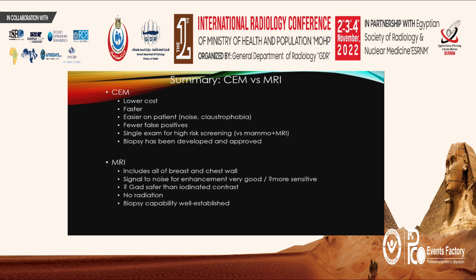So to summarize, CEM has some advantages over MRI. It's lower cost and faster, it's easier on the patient, it has fewer false positives, and it's a single exam for high-risk screening, as opposed to MRI, which requires a mammogram to detect calcifications. We now have contrast-enhanced biopsy.